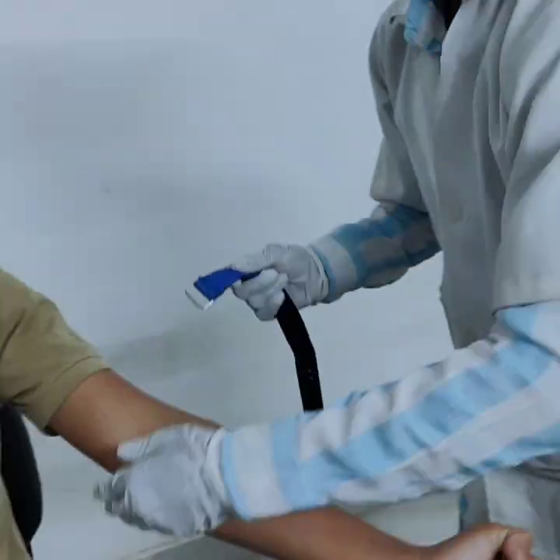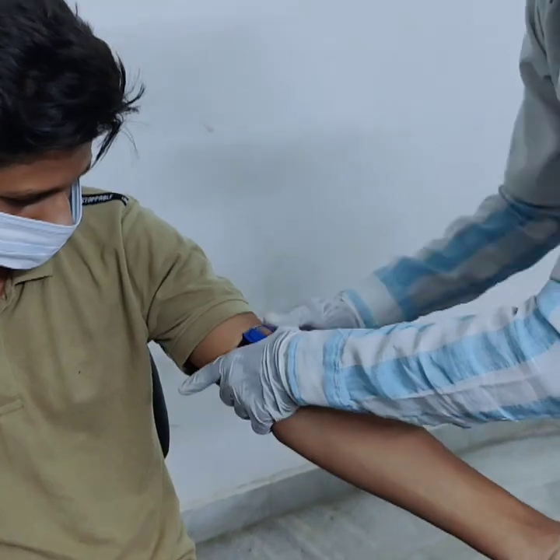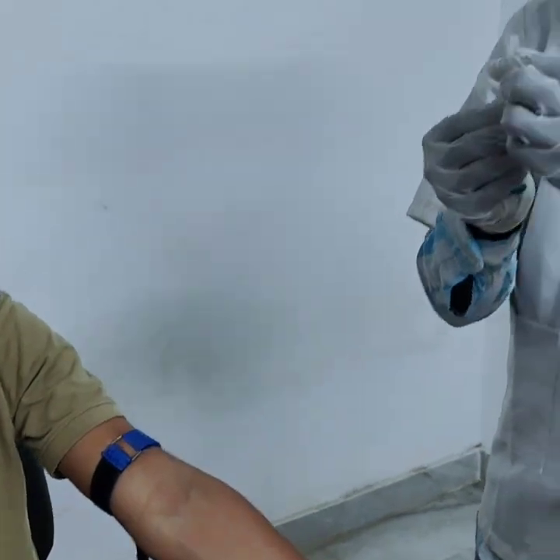Then, tie the tourniquet about 3 to 4 inches above the elbow. Ask the patient to make a fist — this helps make the vein more visible.